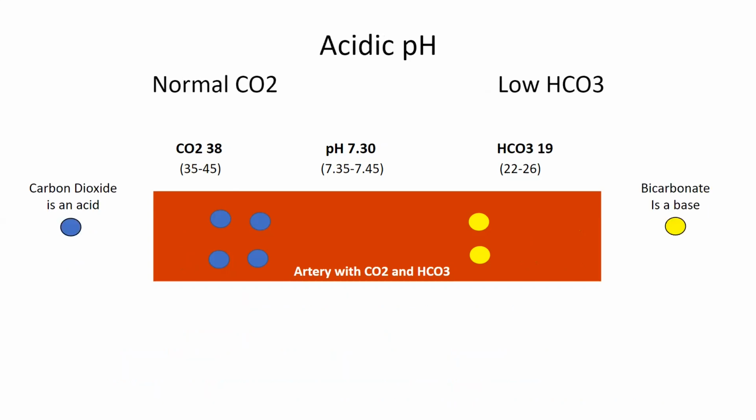Okay, this slide shows acidosis. You can see that the pH is low, and also the image where there is more CO2 acid than HCO3 base. Again, please use slide 3, basic ABG evaluation steps, to follow along in determining what the cause is. Here, the acid, the CO2, is normal, so it's not a respiratory issue.